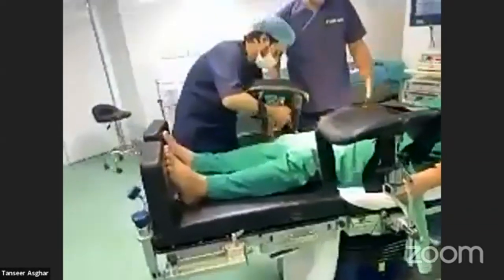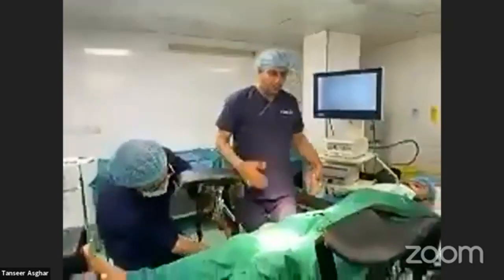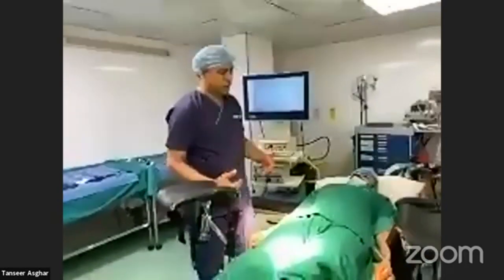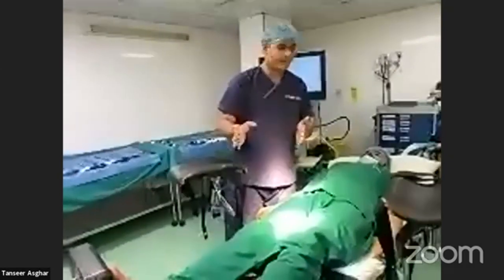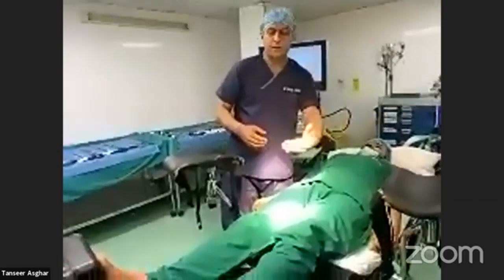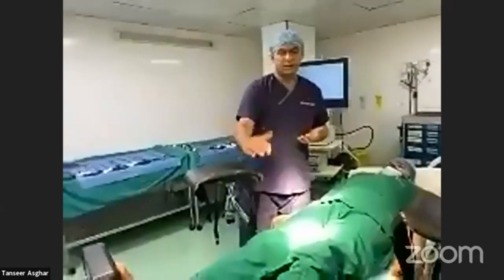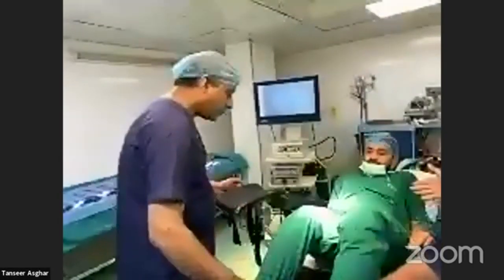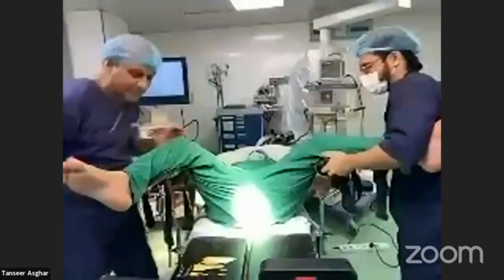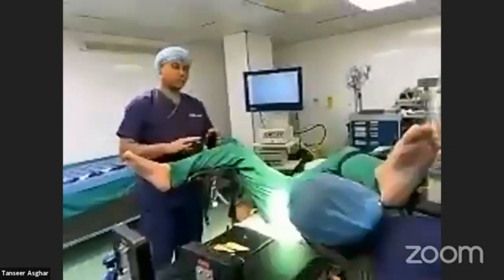We are now demonstrating the reverse Trendelenburg position. In gynecological procedures and for anterior resection or APR, a lithotomy position is also required during laparoscopy — both for lap-assisted and total laparoscopic procedures. We will quickly attach the lithotomy poles.